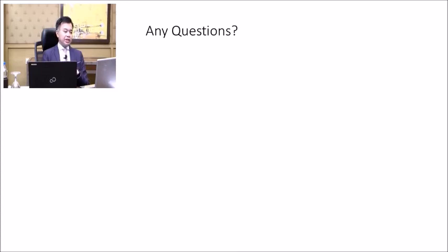Does measuring corneal aberration preoperatively help to avoid postoperative complaints of glare? Absolutely, absolutely. You must measure corneal aberrations. Patients with significant levels of corneal aberrations preoperatively will not do well with a premium IOL, even if it's a Symphony, postoperatively. Not just with glare and halos, but quality of vision, contrast, all those sorts of things. So that's really important.